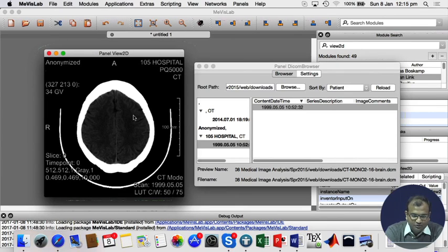When you look over here, you would see all of this in terms of your Hounsfield unit. As I go in air, it gives me a negative gray value, GV, over here. In bone, it is somewhere around 500. In gray matter and white matter, around 30s is what I am getting. This is basically the metallic lining of the cup on which the patient's head was resting, that is why this U shape comes down over there.